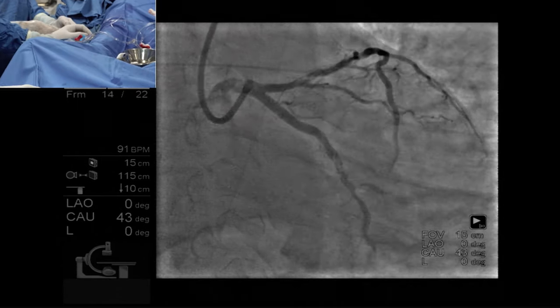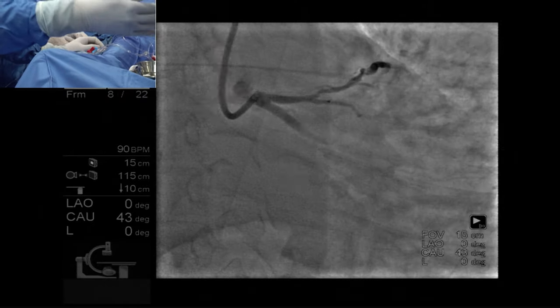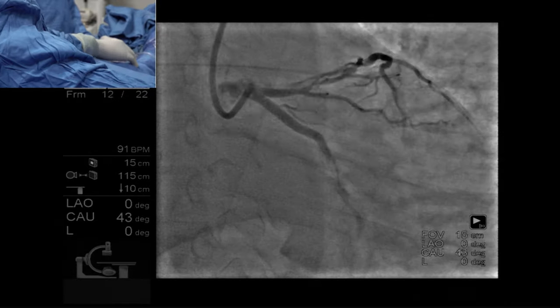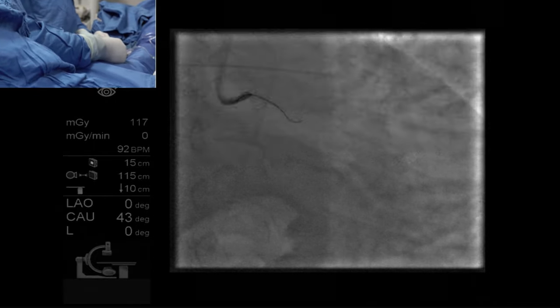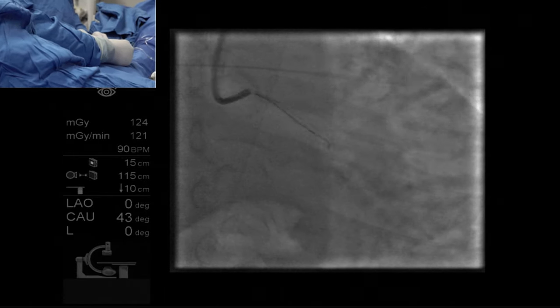Okay. Let me see the picture. Can you play that scene for me first? So which is the main channel, do you think? It looks okay. I think both of them seem to connect. The one towards the apex is the better one, I think. The one towards the apex has better odds. The one towards the atrium is worse.